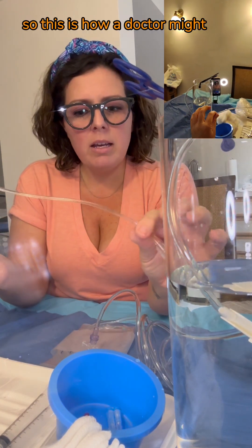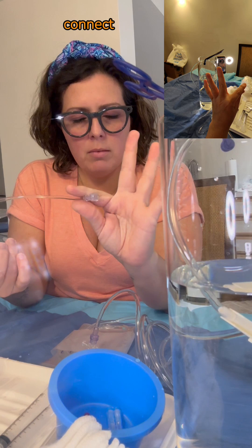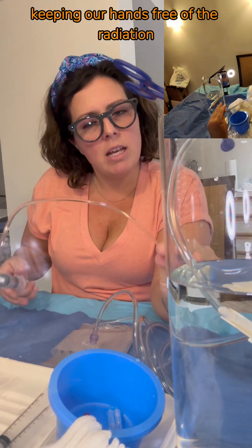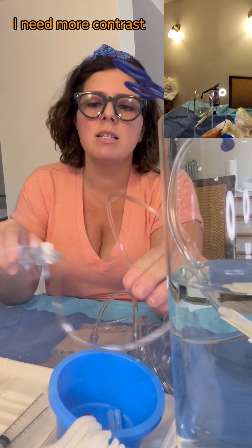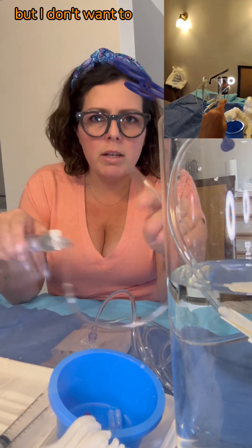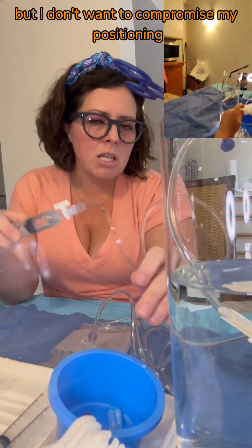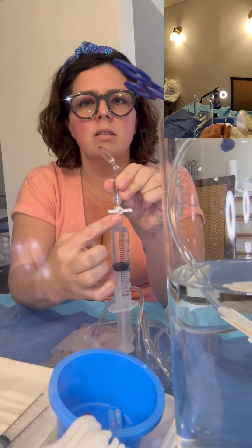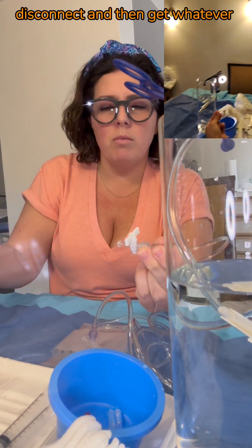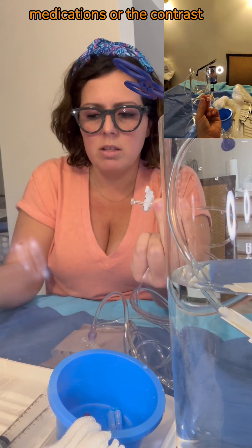This is how a doctor might connect to a needle, keeping our hands free of the radiation, and inject the contrast. So he's like, I need more contrast, my thing's out, but I don't want to compromise my positioning. So we close the one-way, close it, disconnect, and then get whatever else you need — medications, or the contrast, or whatever.